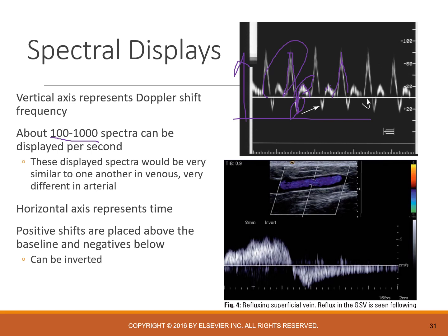Now, most of the time in our venous system, we're hoping our blood doesn't reverse very much because that would probably indicate that there's some faulty valves. But in this particular case, you're seeing that forward and that reversed movement. Some of that can have to do with just the patient breathing, but we call this a phasic waveform. It moves with our respiratory phases, not with this pulsatility that our arterial side is gonna move with.